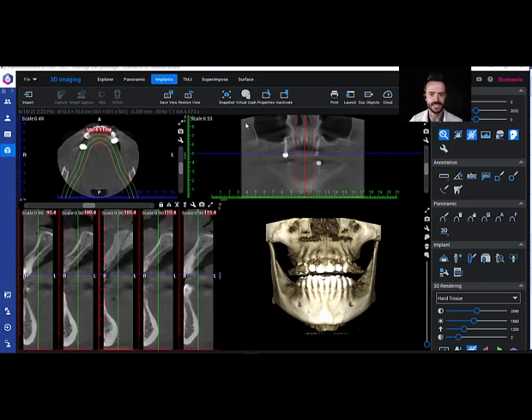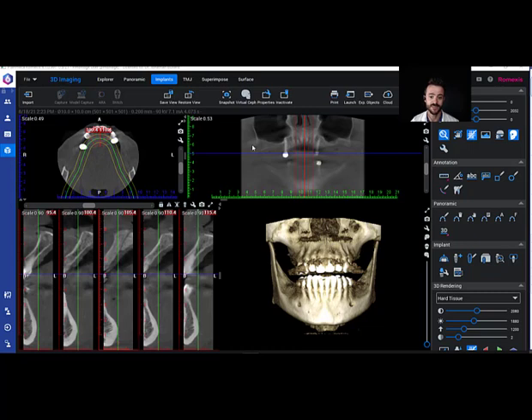Today I'm going to show you a basic setup for Romexis. This is a patient who came in yesterday and we needed to evaluate where we had bone grafted at the site of number 5. Our team took a scan, and what I want to show you today is how to properly align everything so that I can quickly look at the scan and get the information that I need.